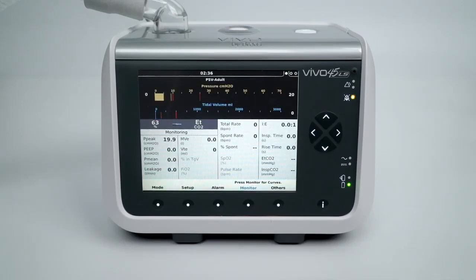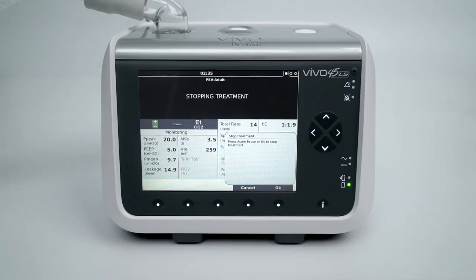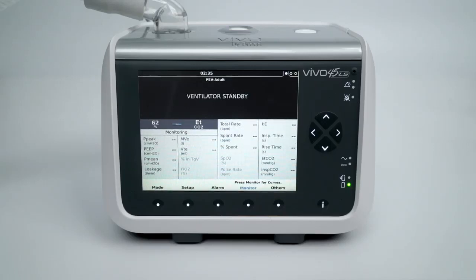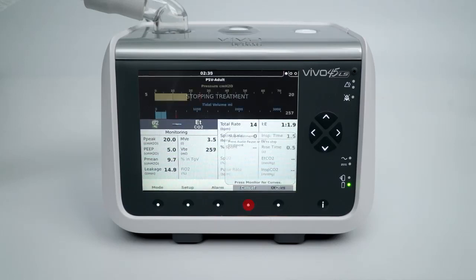To stop ventilation and enter standby mode, first press and hold the Start-Stop button on the front panel. Release the Start-Stop button when the progress bar is filled. Second, press the button underneath the OK option or the audio pause button. To cancel the stopping process and continue treatment, press the button underneath the Cancel option.